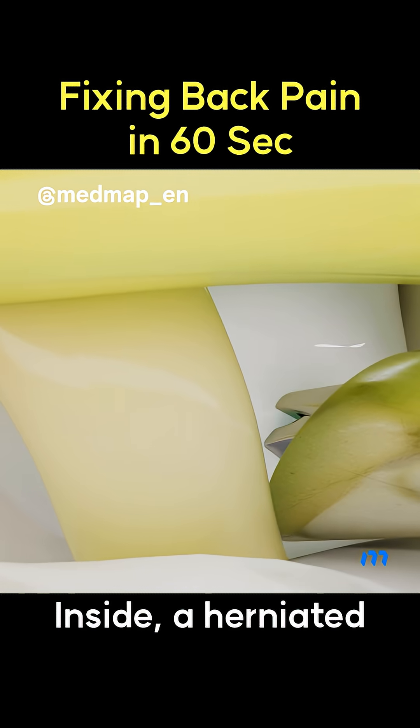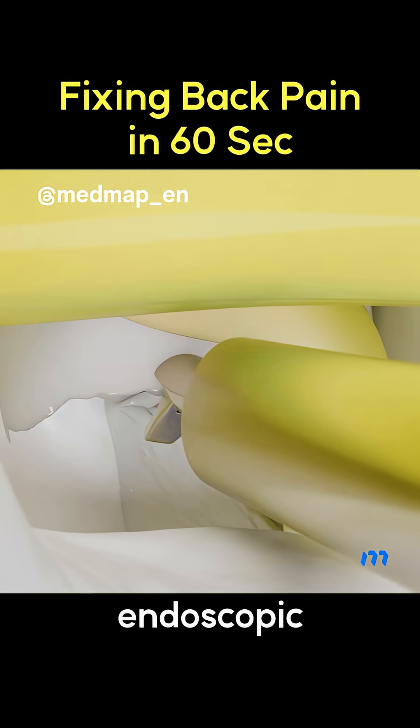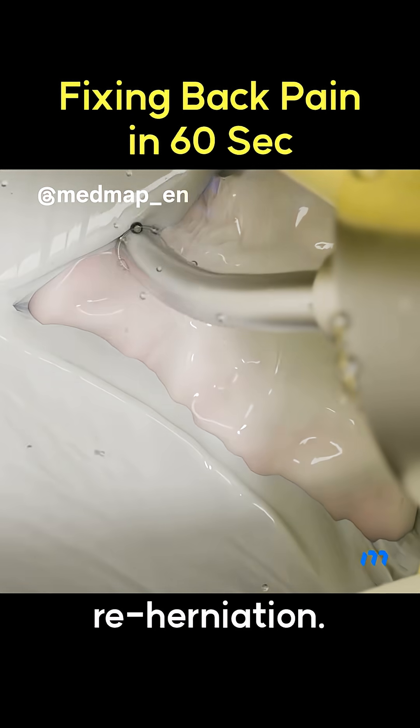Inside, a herniated disc is found pressing the nerve. With precise tools, the disc fragment is grasped and removed using endoscopic forceps, confirming complete removal. The torn disc wall is sealed with heat to prevent re-herniation.